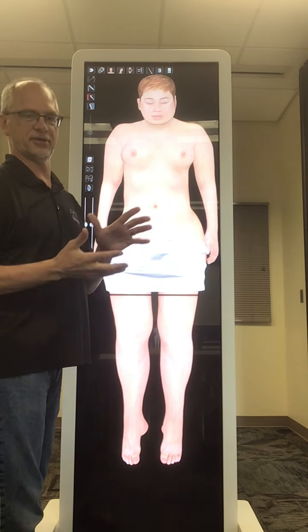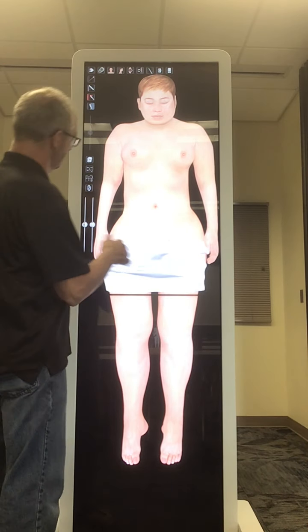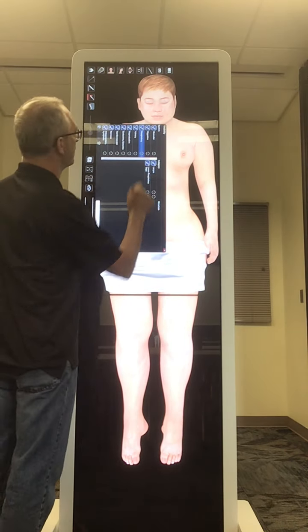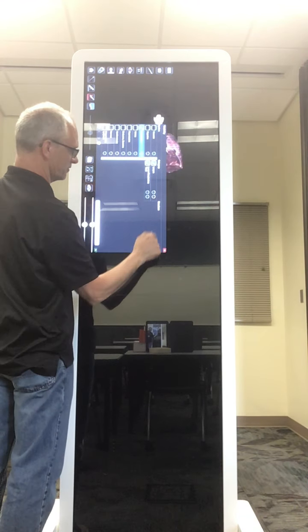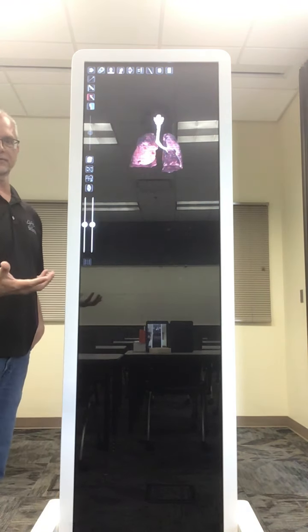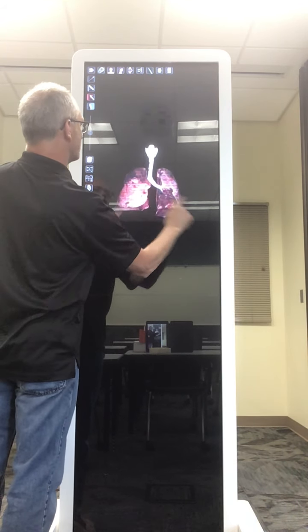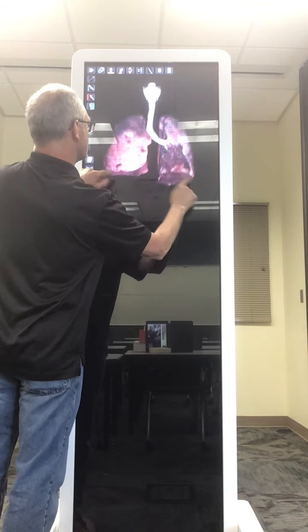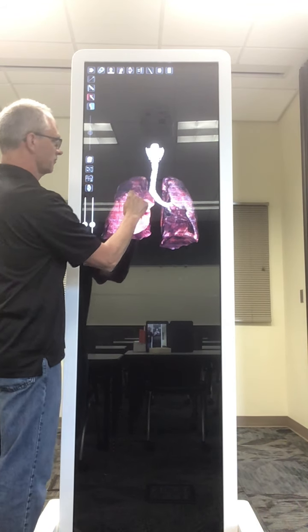So I can do a lot of things with this. I'm going to start by isolating that system. I can take any of the systems and I can isolate them. So I'm going to do that. We'll get rid of her completely, and then we'll go to the respiratory system, and now you can see it. So we can bring this down here. We can make this much bigger so you can see it. And then we can turn it around a little bit.